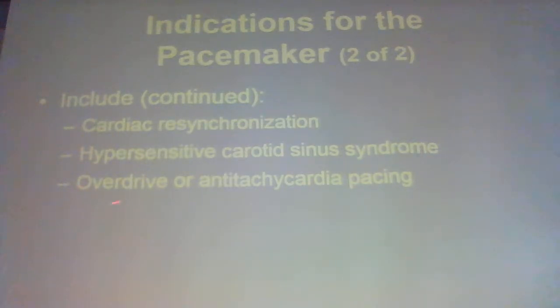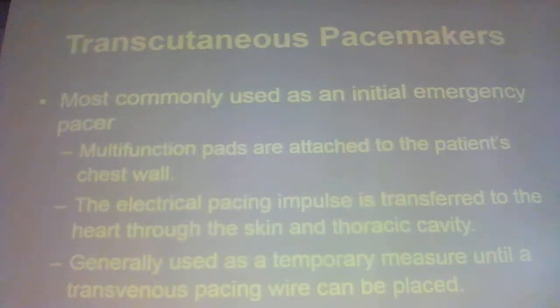And then we can do overdrive or anti-tachycardic pacing. Has anybody ever seen an overdrive pacer? This is somebody that won't slow down no matter what you do to them. Cardioversion, whatever, they won't slow down. So you turn your pacer up, you capture it, and then you try to slow their rate down with it. Does that work? Yeah. You just turn your milliamps way up when you do that? Yep. Turn up till it captures it, and then start backing it back off.